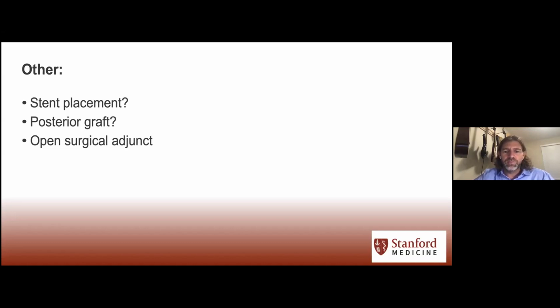And then balloons are great for open surgical adjuncts. We just showed photos of patients who have primary stenosis, have not had open laryngotracheoplasty, but many times after we do a laryngotracheoplasty with rib grafting or a cricotracheal resection, it's not perfect, and a balloon dilation here and there can actually be quite helpful. It can be helpful in the perioperative period after a certain period of time passes, depending on the operation. But it can also be helpful for maintenance for these children as they grow after airway surgical reconstruction.